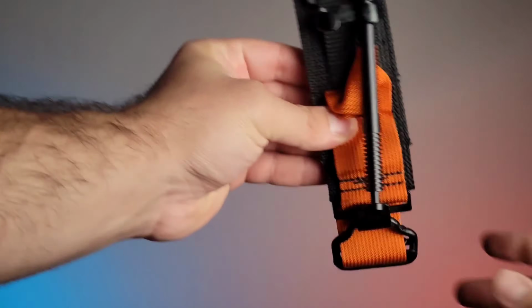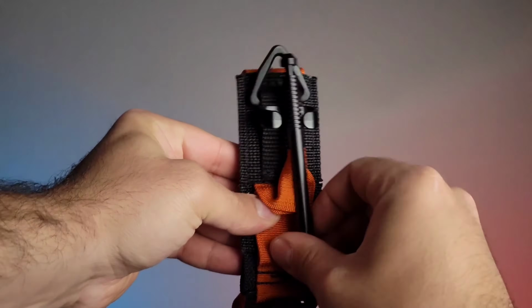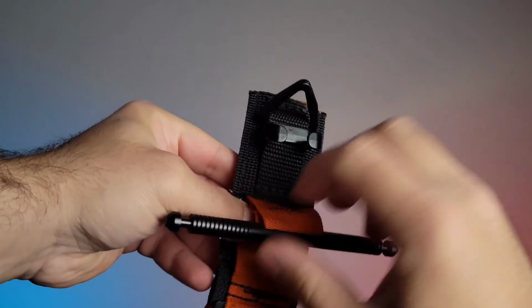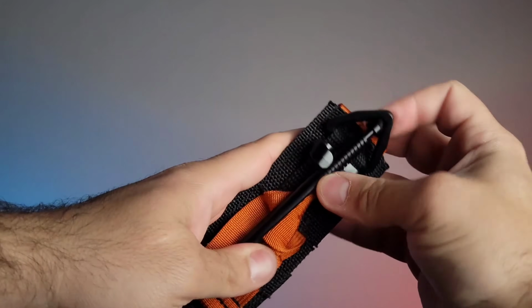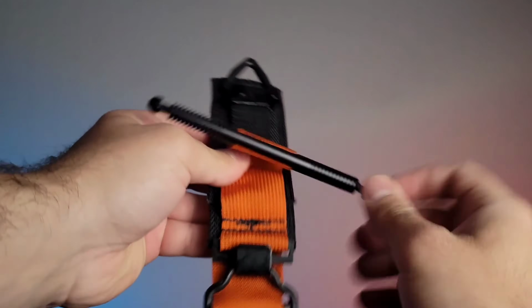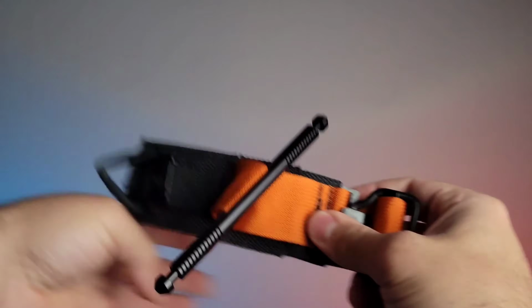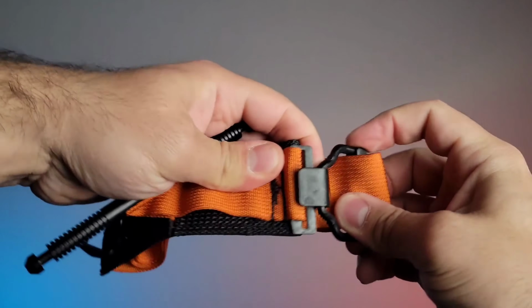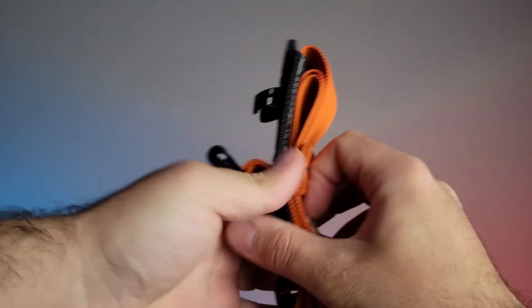The next tourniquet that comes up is the SOF-T Wide Tourniquet. Now, this is another tourniquet that can be folded a couple of different ways, but it's a very loose material. It's still fairly thick. It has buckles and metal clamps, things like that. This functions very similarly in concept to the CAT tourniquet, but it has a little bit more going for it in regards to width and size. It also is much flatter when it comes to packing it up, so you could carry this a little bit easier. I did bring this as an option.